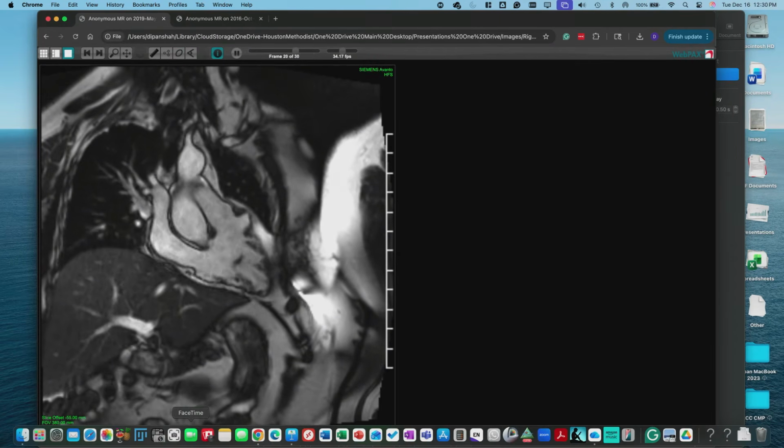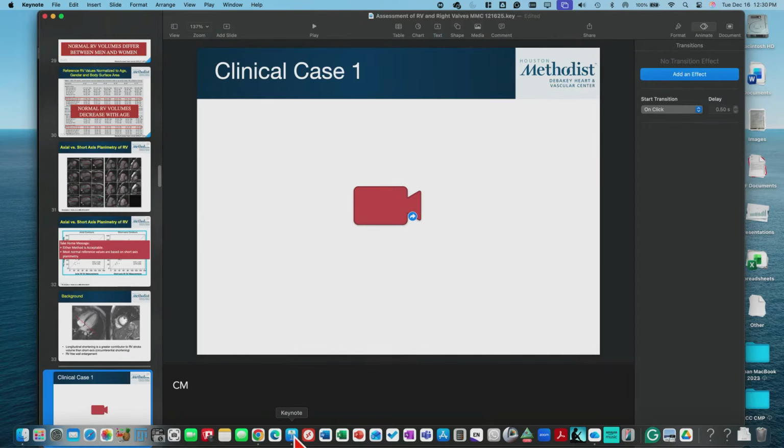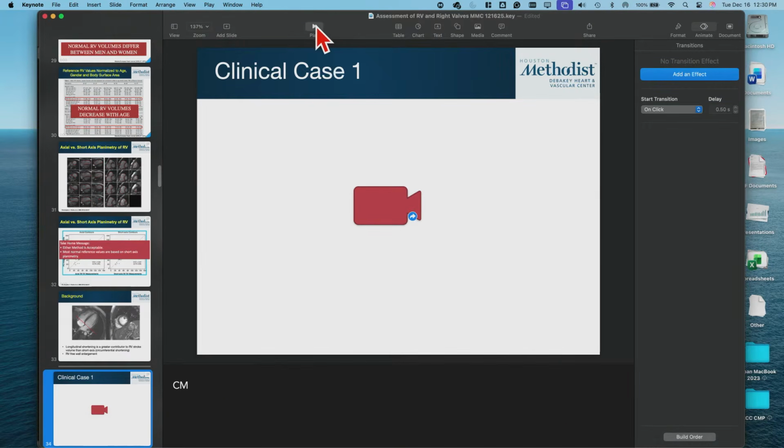So you were worried about the diagnosis of RV dysplasia, right? So now recognize the way you make that diagnosis, you have specific criteria, right? It's not just kind of, I see it, right? So we have specific criteria. What are those specific criteria for RV dysplasia?